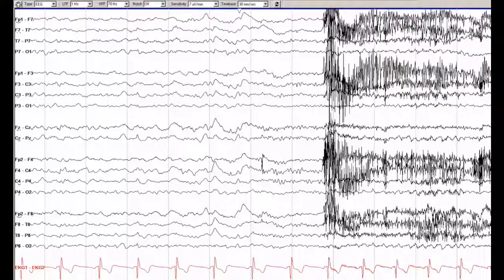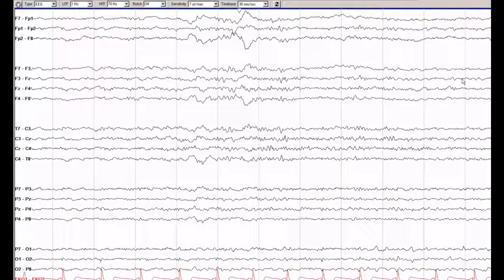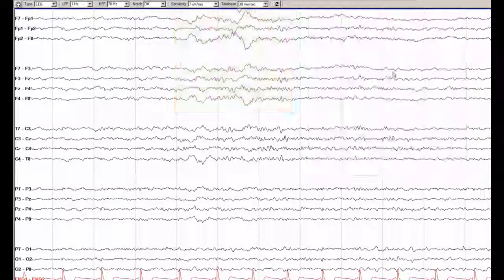If you look at this part of the sleep recording, you can see that there is a string of two K complexes that then precede an arousal, which is indicated by the increased muscle artifact and the loss of sleep transients. Here, I have switched to a transverse montage, which, as I said before, can be a useful way of looking at sleep transients, which are often maximal in the midline. You can see that the K complex has a slightly different location than the vertex waves, which were maximal at CZ. These K complexes are slightly more frontal maximal, although they do have a broad field.